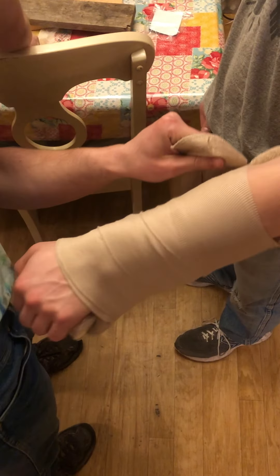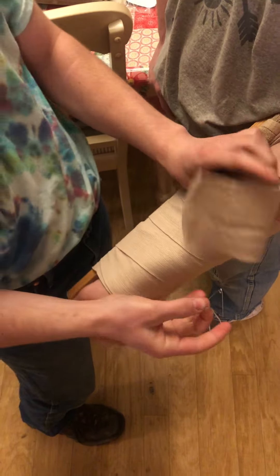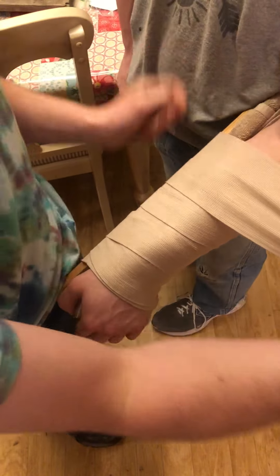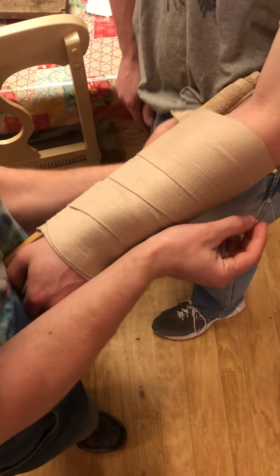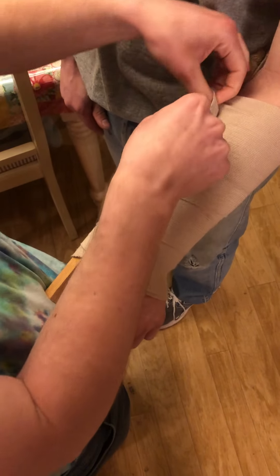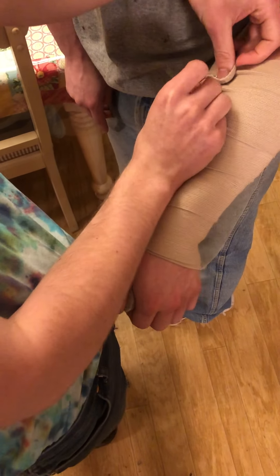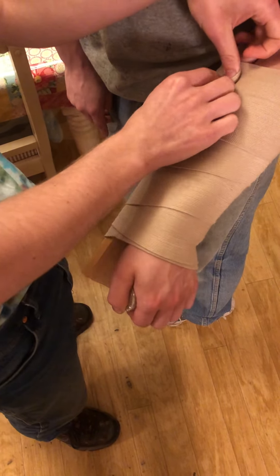And then you will secure it with a safety pin, making sure it doesn't come loose. And you will secure it.